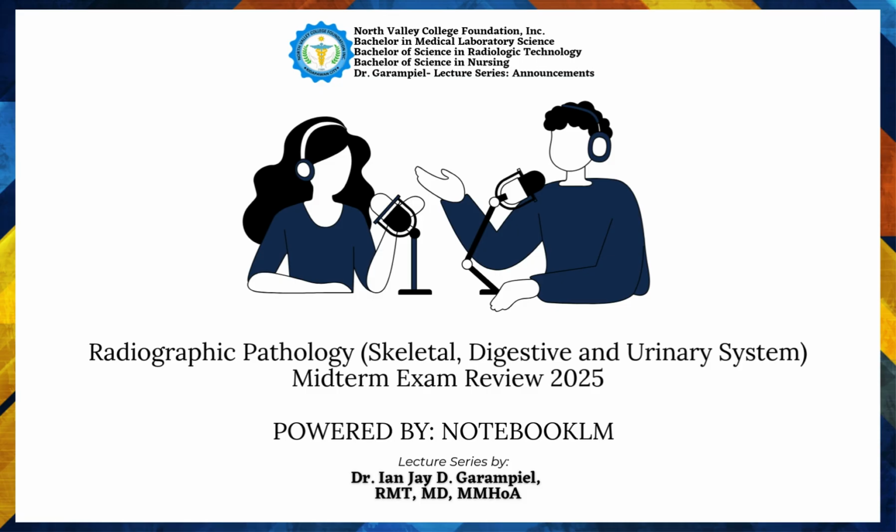Got it. We end with one last vital visual distinction: the difference between a benign fluid-filled mass and a potentially malignant tumor in the kidney. Right. On imaging, a benign renal cyst has really textbook features. A perfectly smooth, thin, often radiopaque rim around a lucent, clearly fluid-filled structure. Sometimes there's a little point where it meets the kidney called the beak sign. Okay, smooth and thin. Exactly. But if you see irregular, shaggy, or thick borders around a mass, that is a massive red flag suggesting potential carcinoma. The quality of that margin, its purity, is absolutely critical for differentiating benign from suspicious.